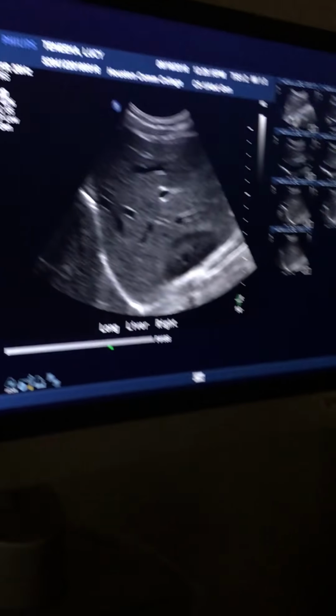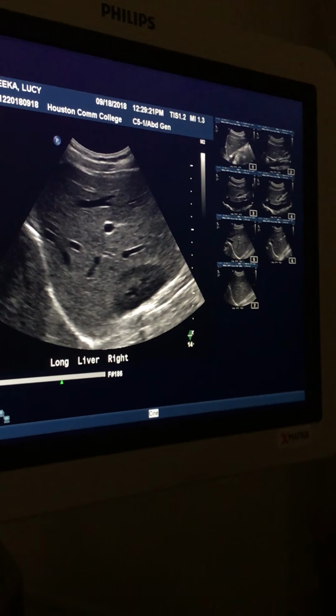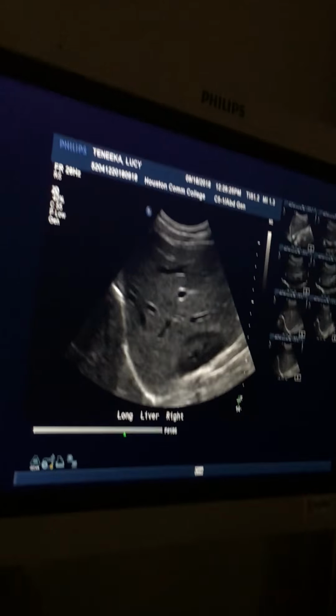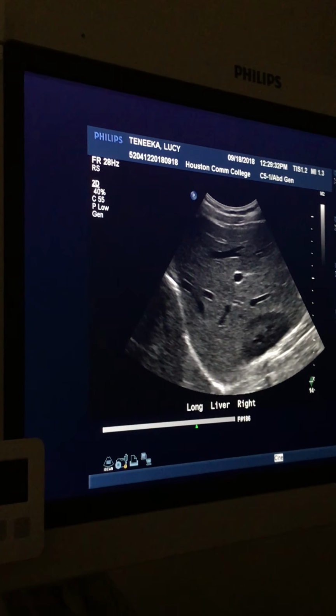So it's really not that much of a movement. It's just all these little things. And of course, because I've been scanning more, I can control my movements a lot easier. So as I go to the next picture, you may have to go toe down, heel down, lateral, medial, whereas I do it as I'm moving because I've been doing it for so long. So it doesn't mean you're just going to go like this and that's it.